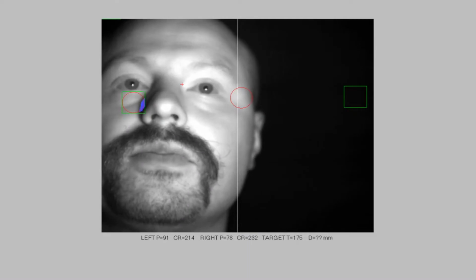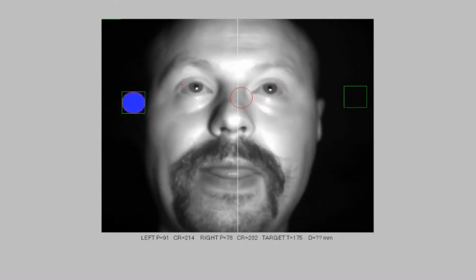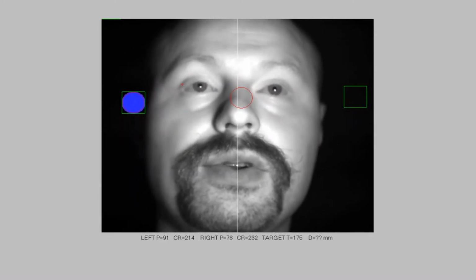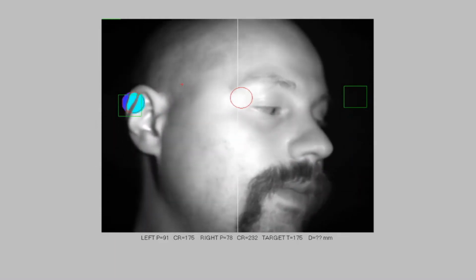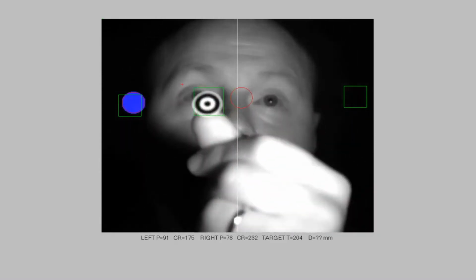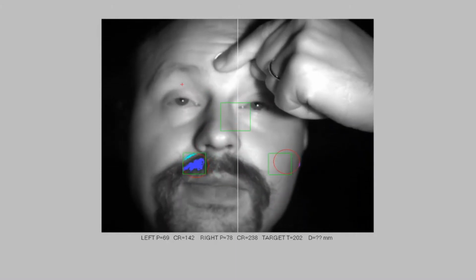Now you can see the gray screen, which indicates that the communication between the display PC and the host computer is well established. If you press enter, we will see what the eye tracker can see. At the moment, the system cannot recognize the position of the eyes. Therefore, for the remote mode, we have to place this target sticker on the forehead of the subjects.